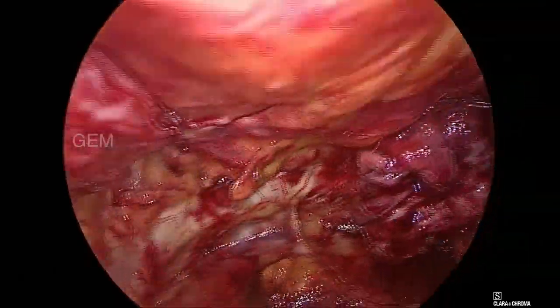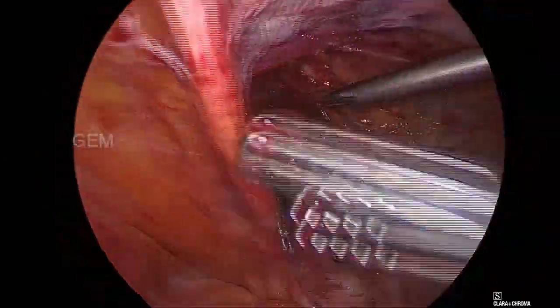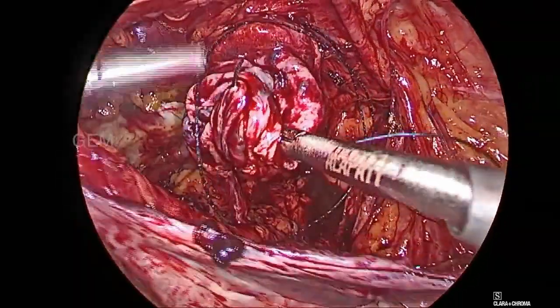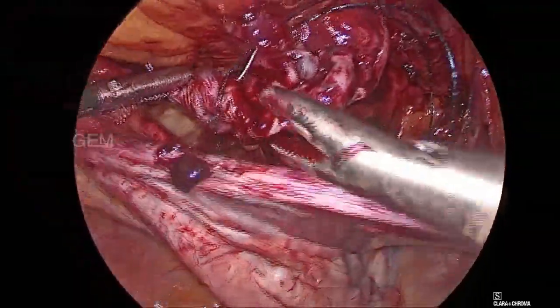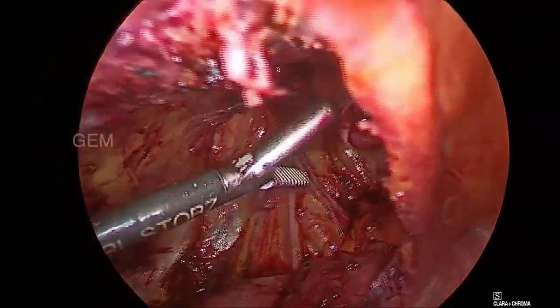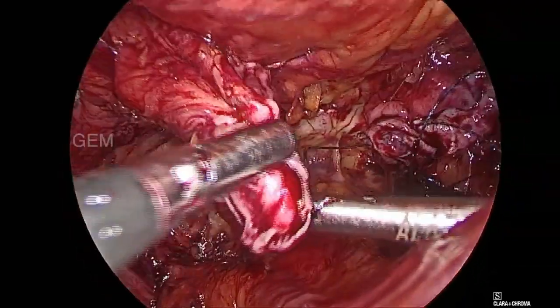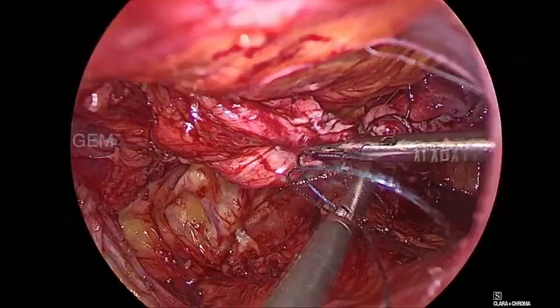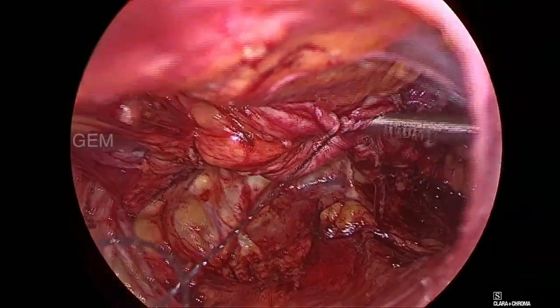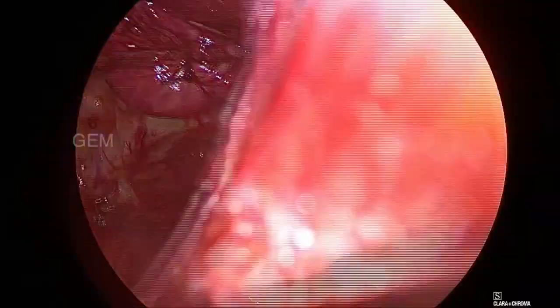Both sides have been plicated but the hanging part will create a problem for the mesh to get aligned. So we try to connect the tips of both sacs to each other in the midline. It is holding nicely.